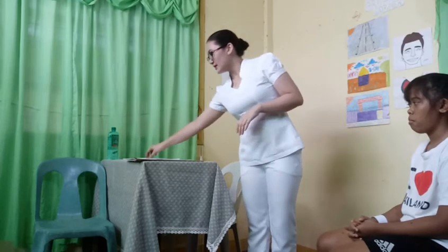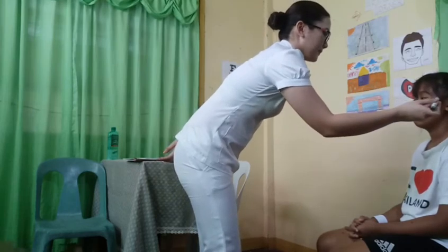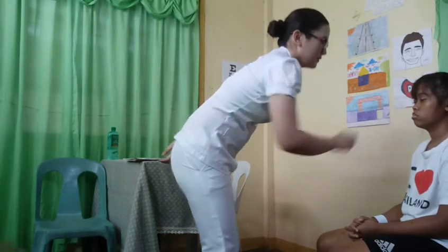Now let us check for the patient's corneas. I'm gonna use the pen light. I'm gonna shine a light obliquely onto the patient's eye to check for opacity and texture. Now, Miss Kaina, I want you to look into the distance, okay? Okay, the other one. So the corneas of the patient are translucent and smooth.